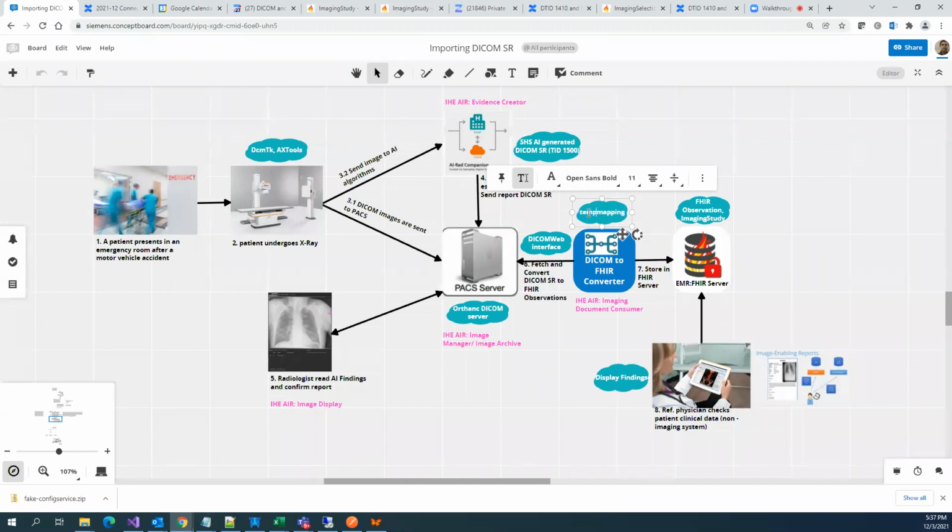There was a question from Venu that we can also use something like liquid.js. Yes, we could go with any template programming, as long as we are working on specific mappings and all of us agree on this mapping. It is from the international draft IG, so we can take it as the starting point and enhance it if needed.